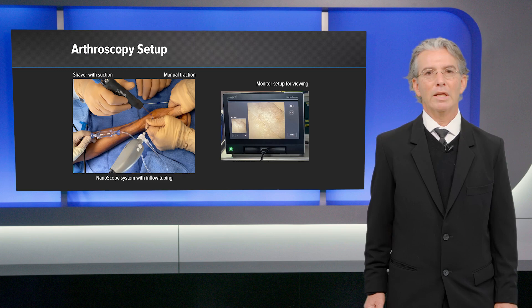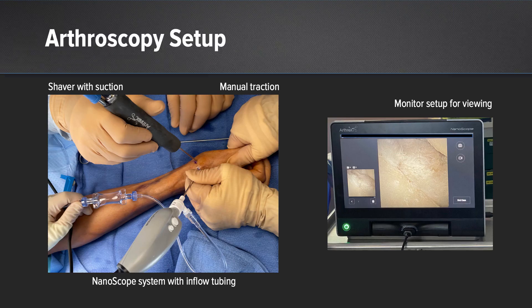Here is our current setup. You can see the 1U portal with the nanoscope and 1R portal for the shaver, with the screen visualizing the CMC joint. You can also see the tubing connected to the nanoscope.